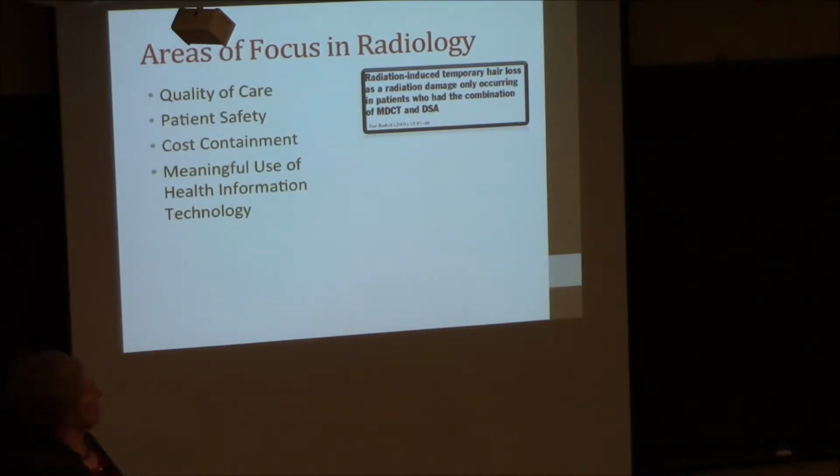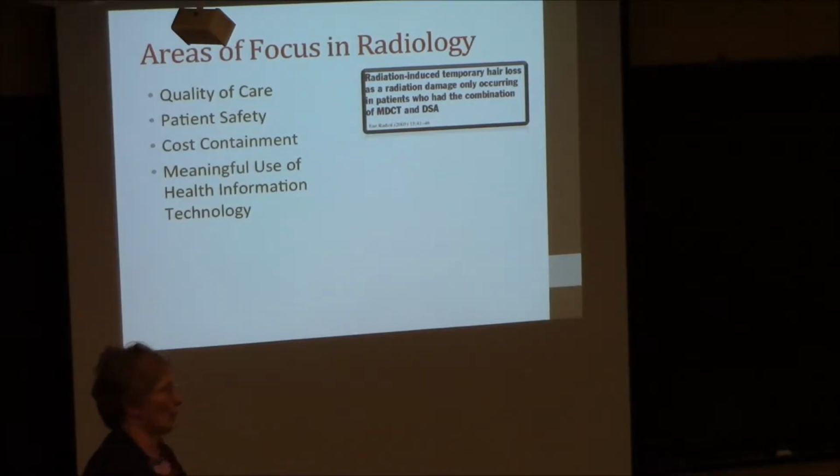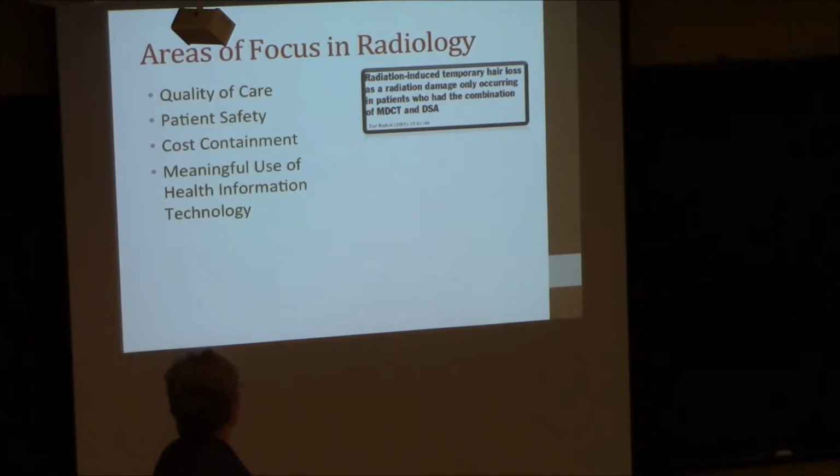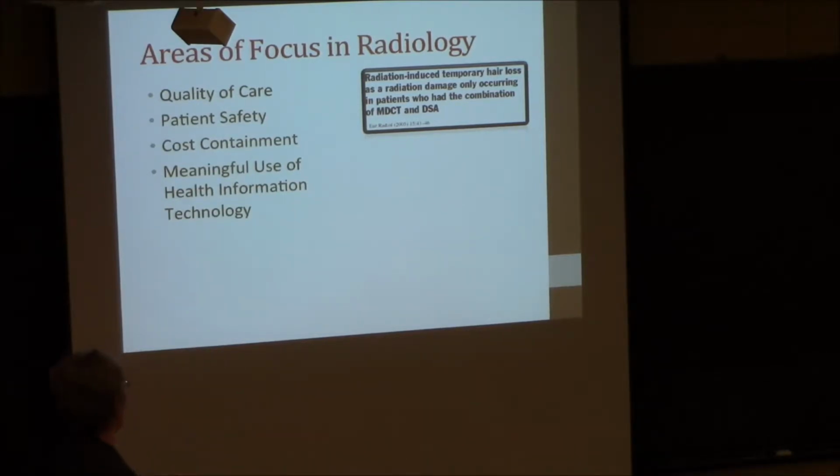But a few years ago, like mid-2005, 2006, all these reports came out about radiation injury being caused by CT scanners being overused, or somebody holding the button down too long, or that sort of thing. And so suddenly that really moved up the gamut of being issues that we have to address. And so there are any number of papers and research being done on radiation safety and radiation control.